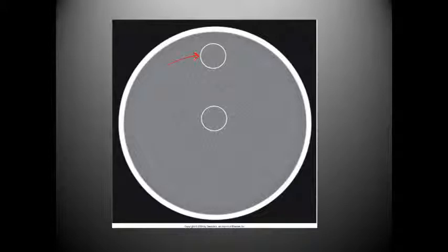We have a region of interest here and a region of interest here. And so if we got a Hounsfield unit for this one of, let's say, -300, then we should get theoretically a Hounsfield reading from this one of -300 because they're the same tissue density. However, if you were to take a region of interest out here, then we would expect to see vastly different areas because we're scanning through bone, air, and even brain.